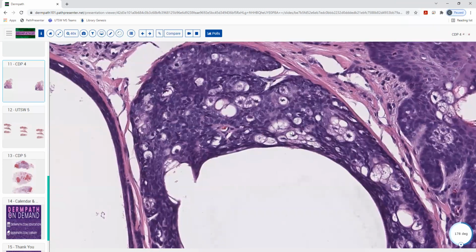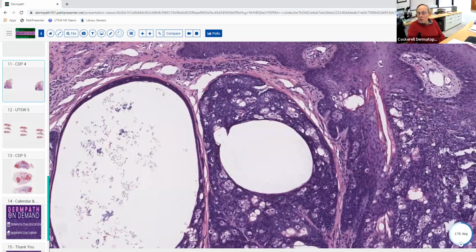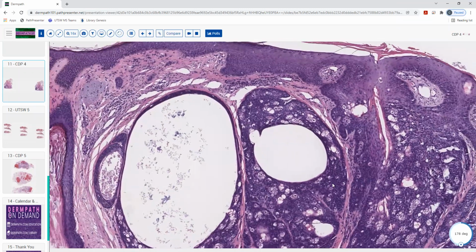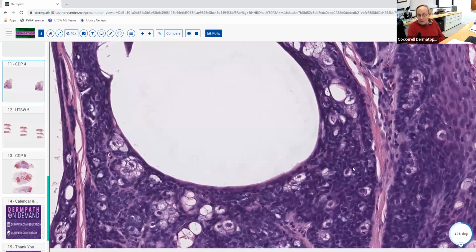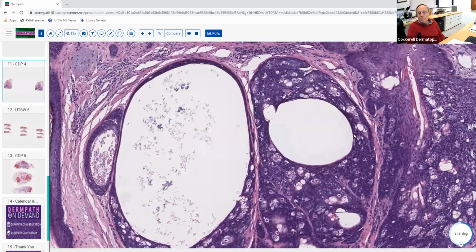I don't think this looks weirder. Absolutely no chance, right? This is not a Fordyce spot. Because we notice here, we've got all these primitive germinative cells. These are stem cells, basically, of the sebaceous gland. They formed a little benign tumor. And these cells have tons of DNA in there. They're rapidly proliferating. They're maturing into these sebaceous cells. And you'll often see mitotic figures in here as well. You don't see atypical mitoses. So this is another benign neoplasm of sebaceous differentiation.